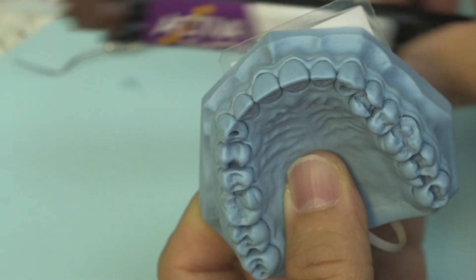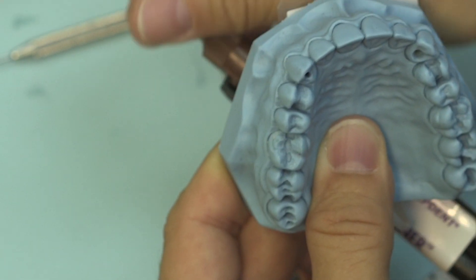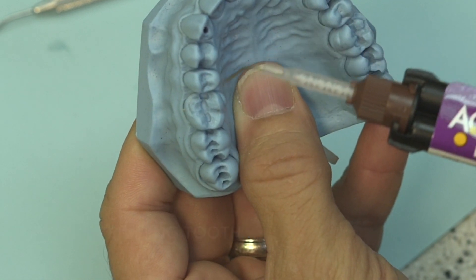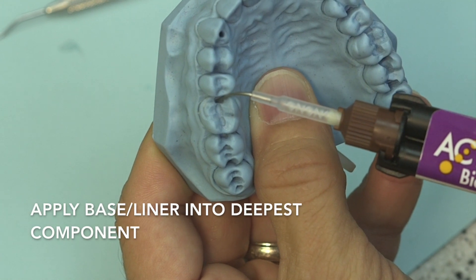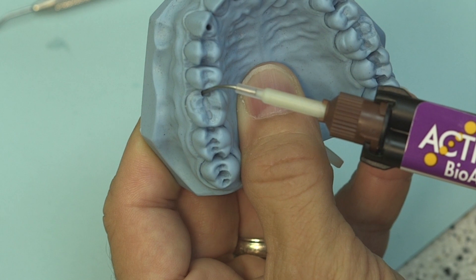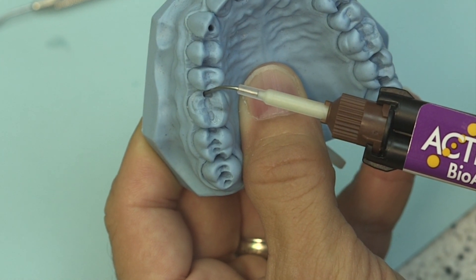So after you have prepped your tooth, you can go in without doing anything else to the tooth and just apply your baseliner into the deepest component. It has calcium and phosphates that will help to protect.